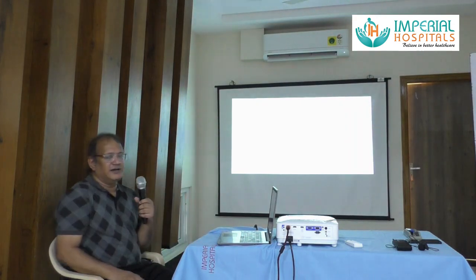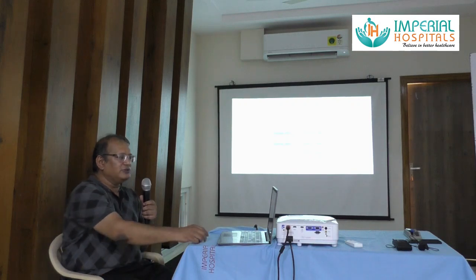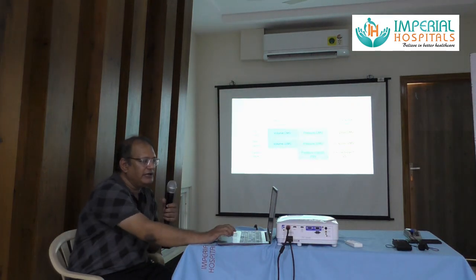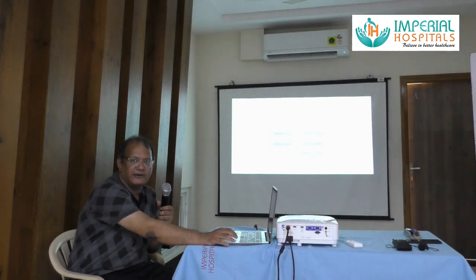So these are the traditional modes of ventilation. CMV modes, depending on what we are controlling, either we are controlling the volume or we are controlling the pressure, or adaptive controlling, where it can be either pressure or volume depending on the patient status. So CMV modes are volume CMV, pressure CMV, and adaptive CMV. SIMV could be again volume SIMV, pressure SIMV, or adaptive SIMV. And support modes, pressure support or volume support.